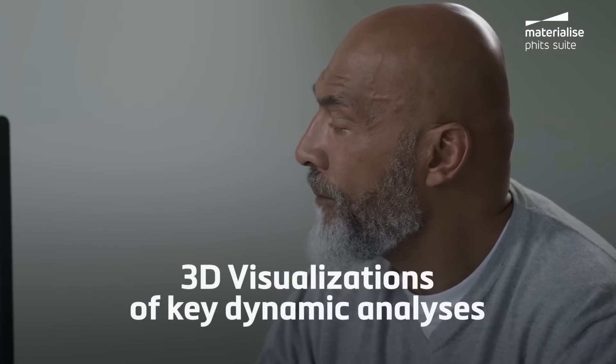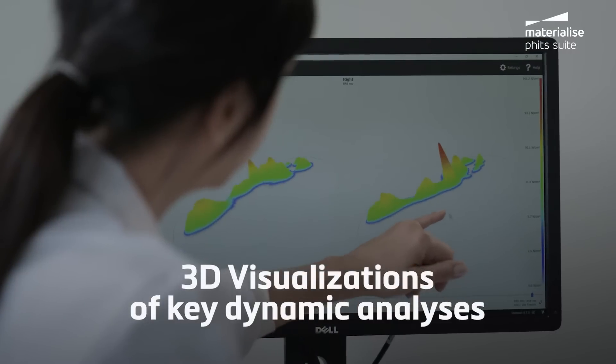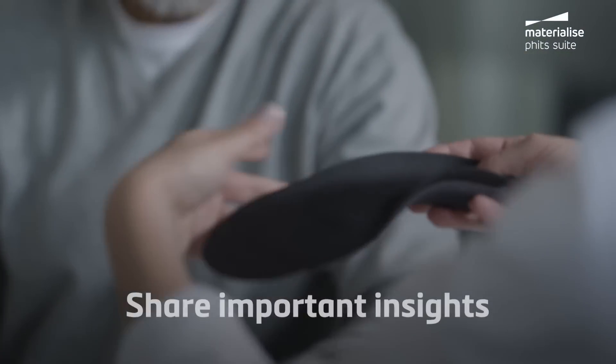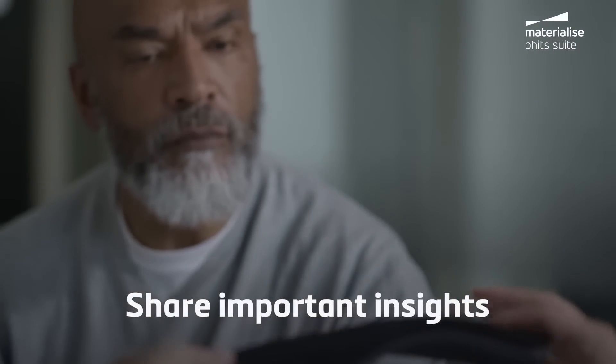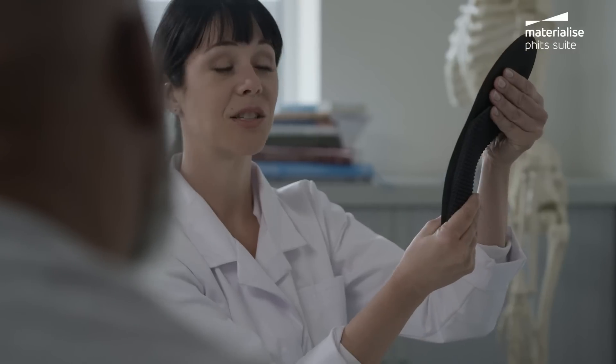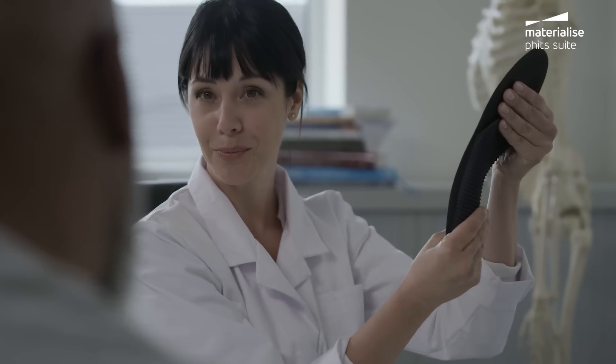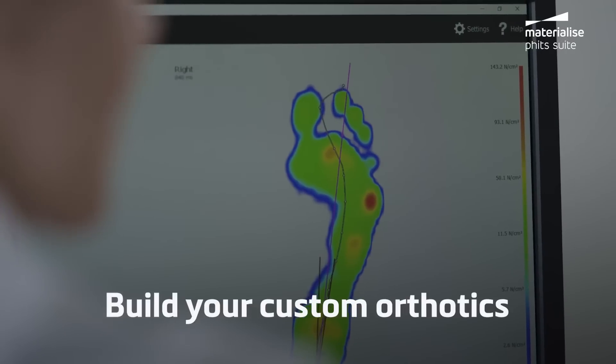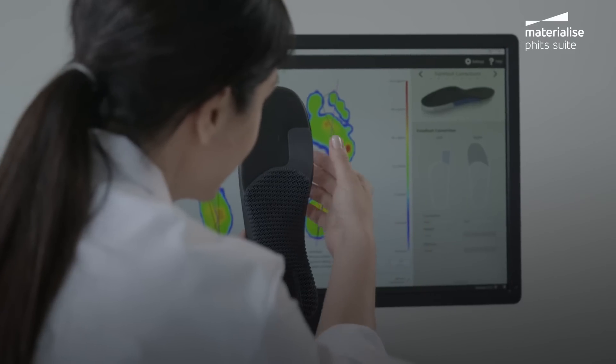See 3D visualizations of static balance and dynamic analyses and clinically relevant pressure characteristics. Compare them with your AI-generated orthotic design and easily share important insights with your patient, improving their understanding and overall experience.